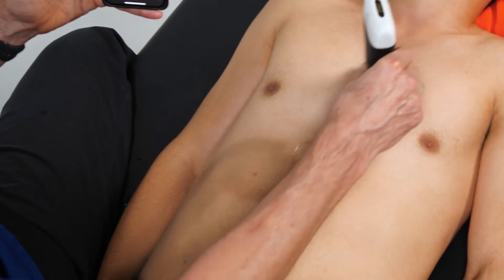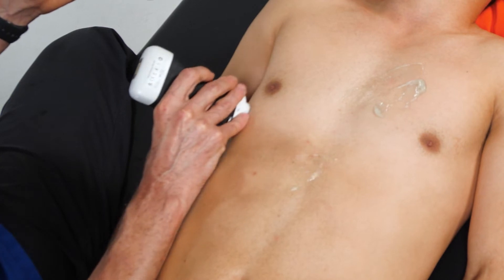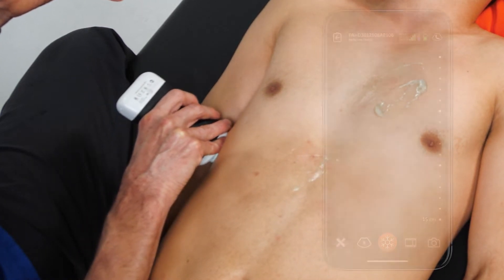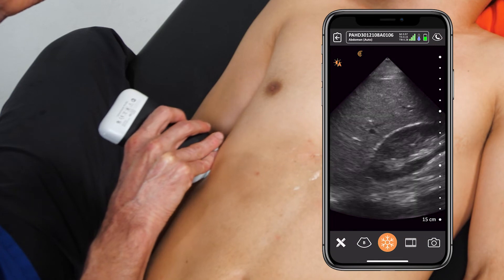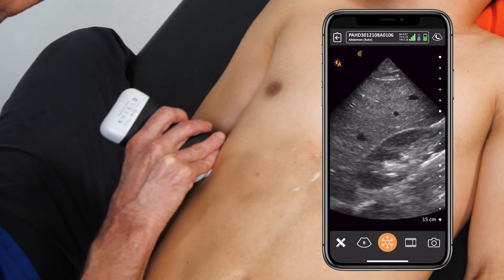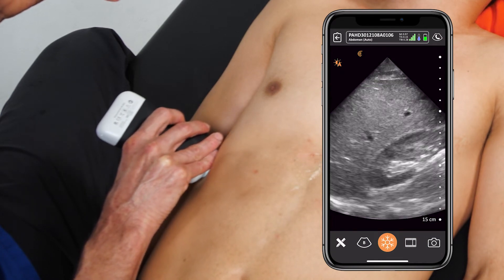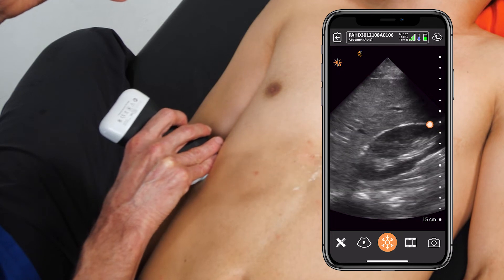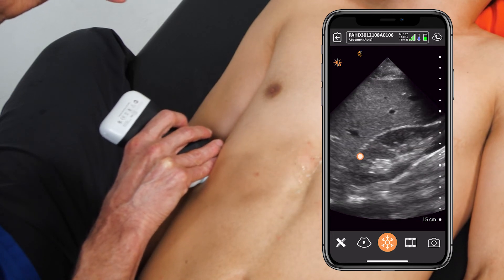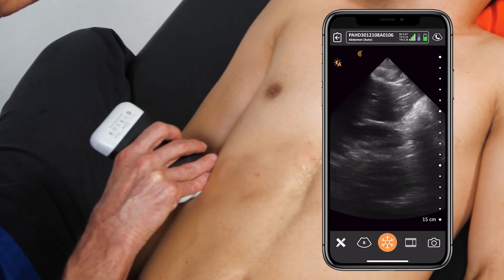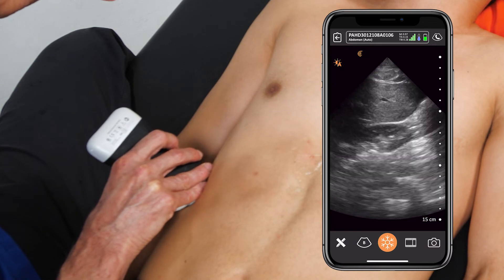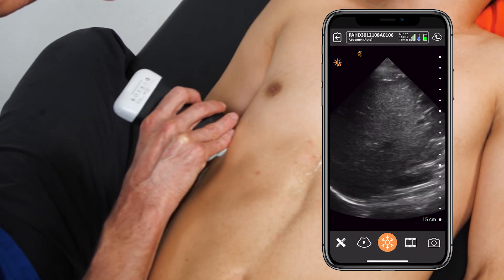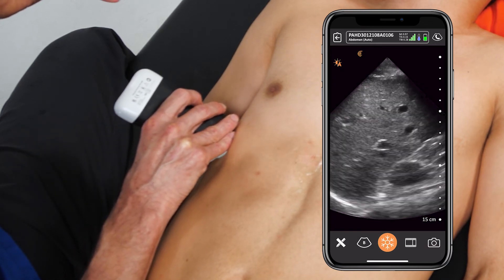After we examine the inferior vena cava, we'll go ahead and move over to the right upper quadrant. Much in the way that we did with the FAST exam, we'd like to look for evidence of free intraperitoneal fluid by looking at the area between the right kidney and the liver, and also examining down by the inferior margin of the liver for evidence of intraperitoneal free fluid.